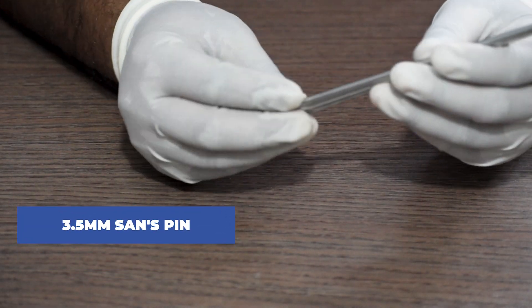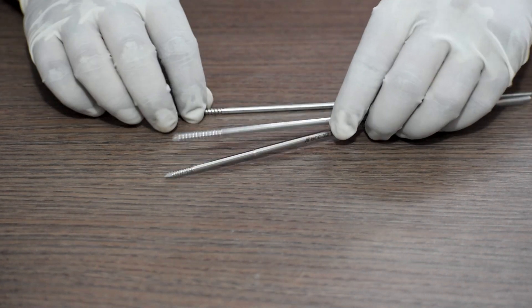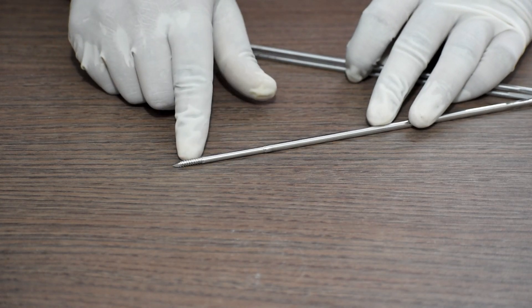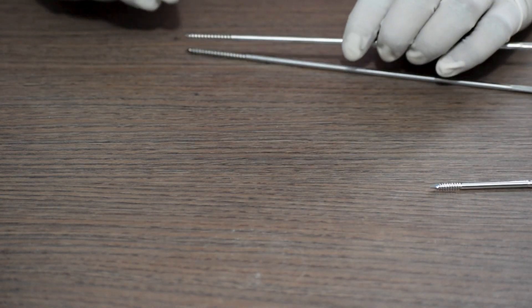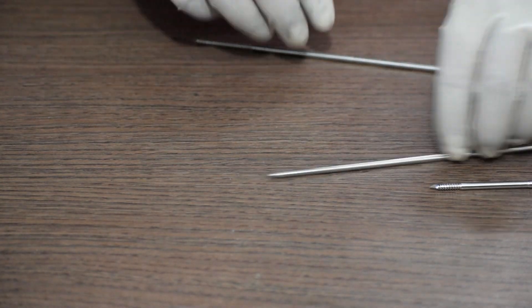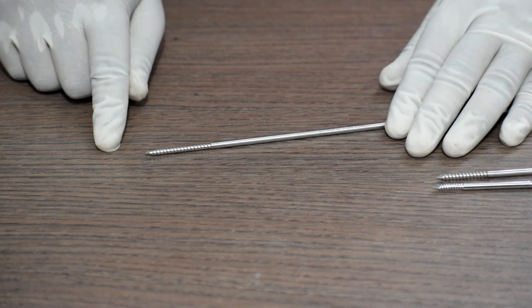Next, this is a 3.5mm Schanz pin, available with different thread lengths: 16 thread, 25 thread, and 32 thread.